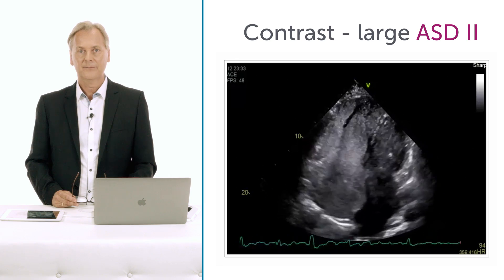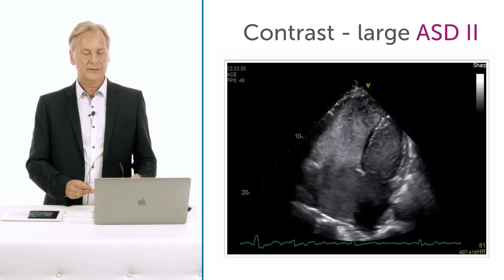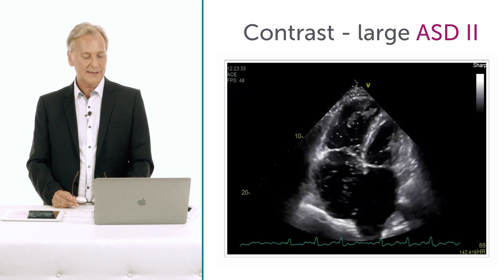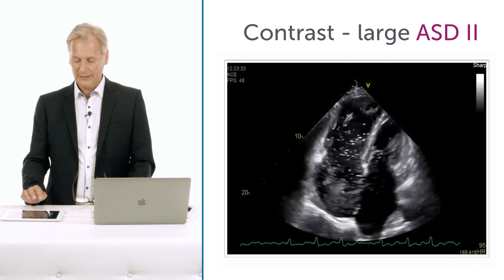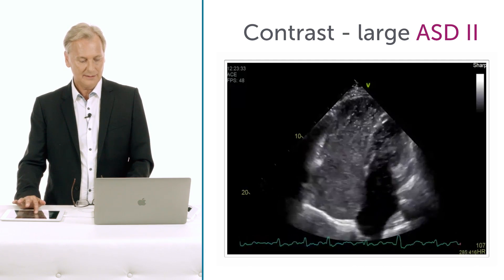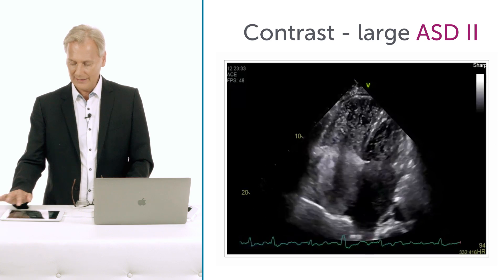Another important modality you can use with transthoracic echo is contrast. Here is a transthoracic study where we injected the contrast into the peripheral vein.